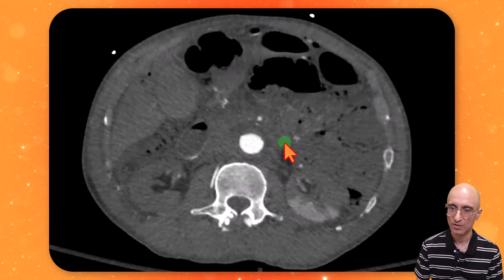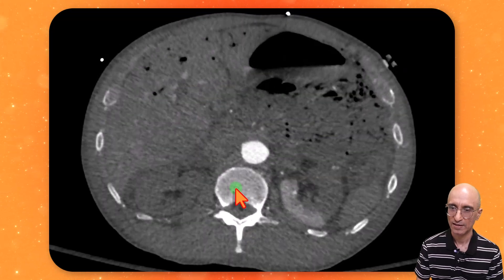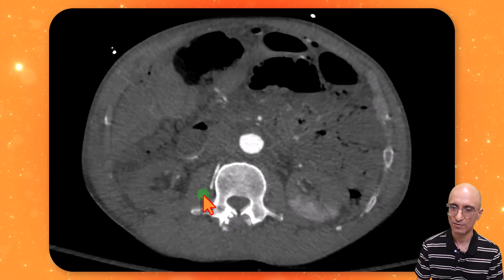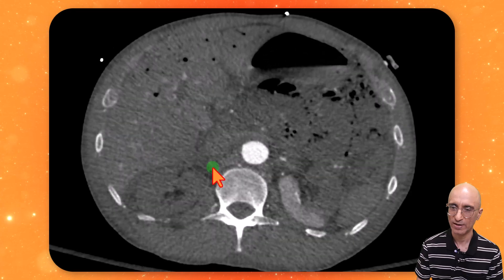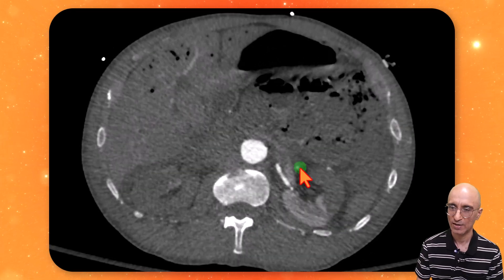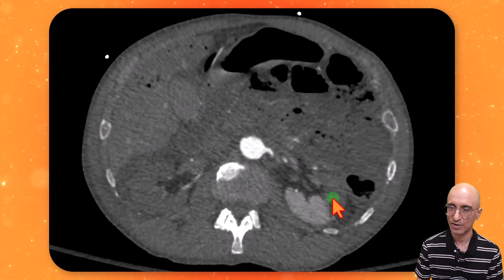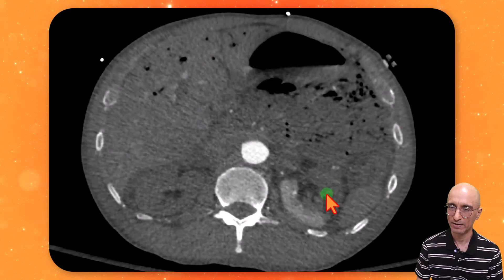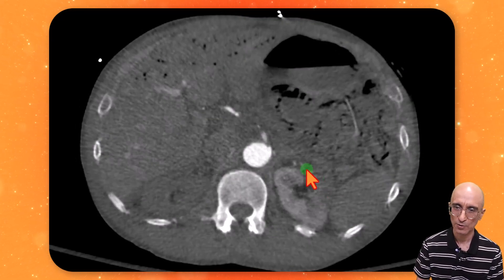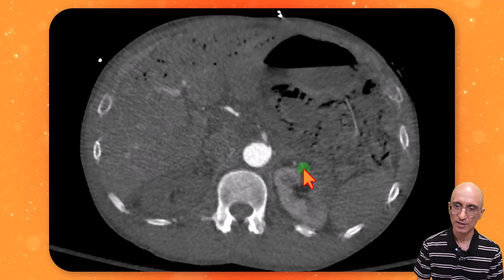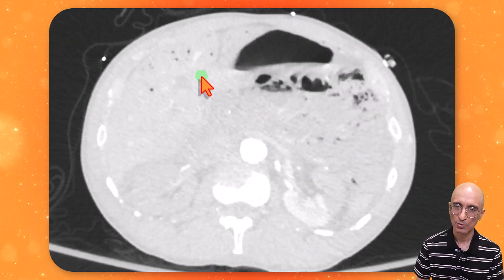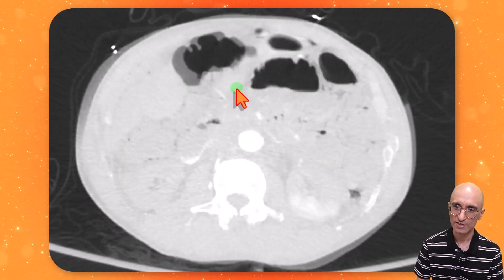Scrolling up higher, you can see that the renal arteries are not opacified on the right side, with some distal reconstitution. On the left side, you can see multiple regions of renal infarction. Also, if you pay close attention to the liver, you can see a large amount of portal venous gas.